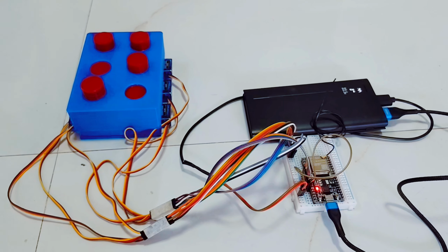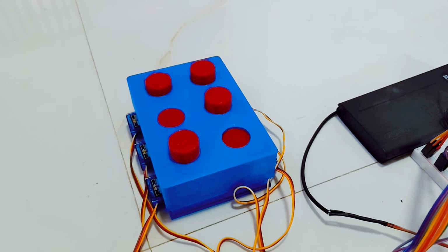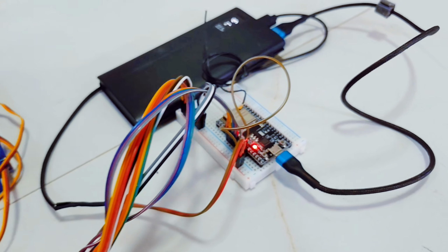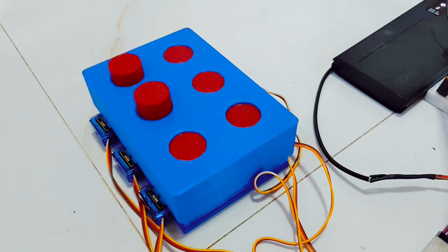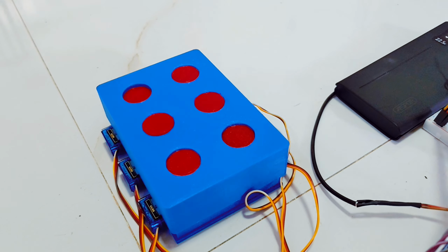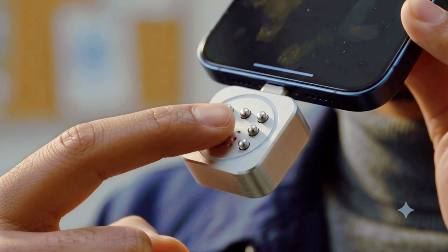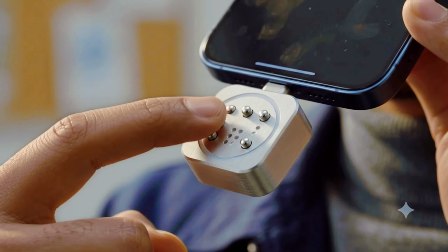I have added 3D printed tactile buttons to demonstrate how this concept could work in a physical device. This prototype shows how digital information can be converted into touch, allowing visually impaired users to receive information through Braille. I believe a system like this could improve independence, support inclusive education, and make documents, signs, labels, and learning materials easier to access. A compact and affordable version could help people with visual disabilities interact with everyday information more confidently, without always depending on another person.